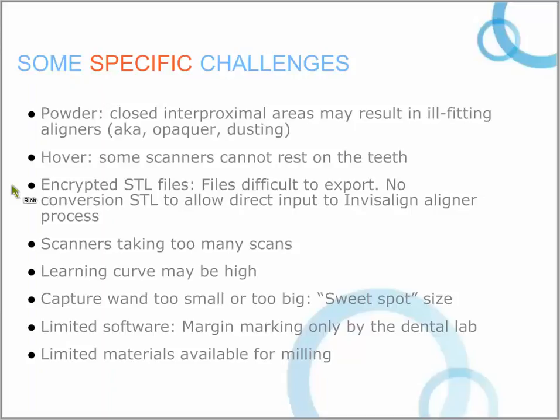Let's stop for just a minute and think. The open source system of iTero lets me send my STL files, for example, to my computer, where I manipulate those files to be able to send to my 3D printers. If I have an encrypted file, I don't have a way that I can send that STL file easily to that computer to be able to then use my 3D printer. So the open source is an issue, and I think it's important for you to think about using a system that doesn't require an encrypted file to be able to export your STL files.